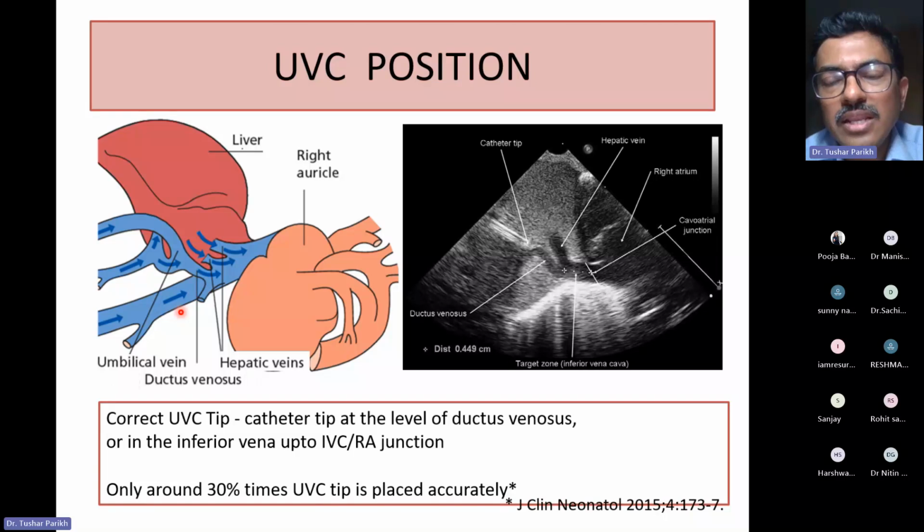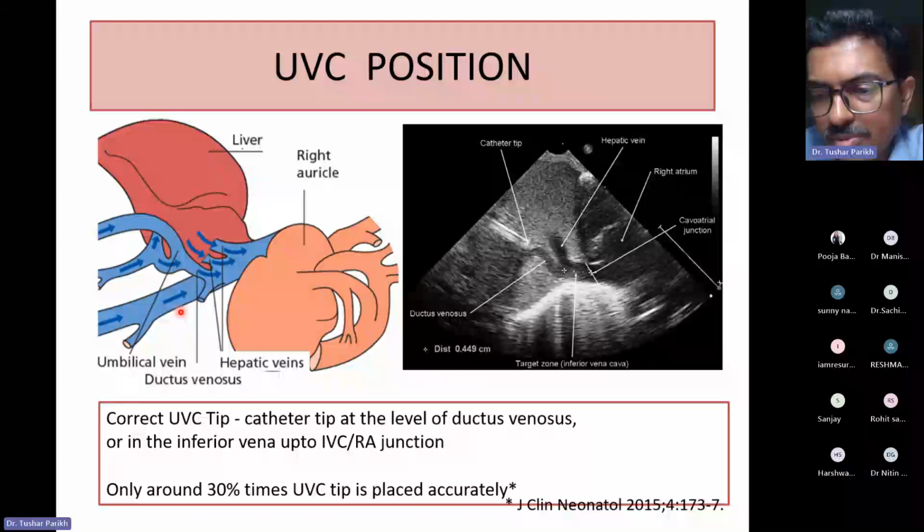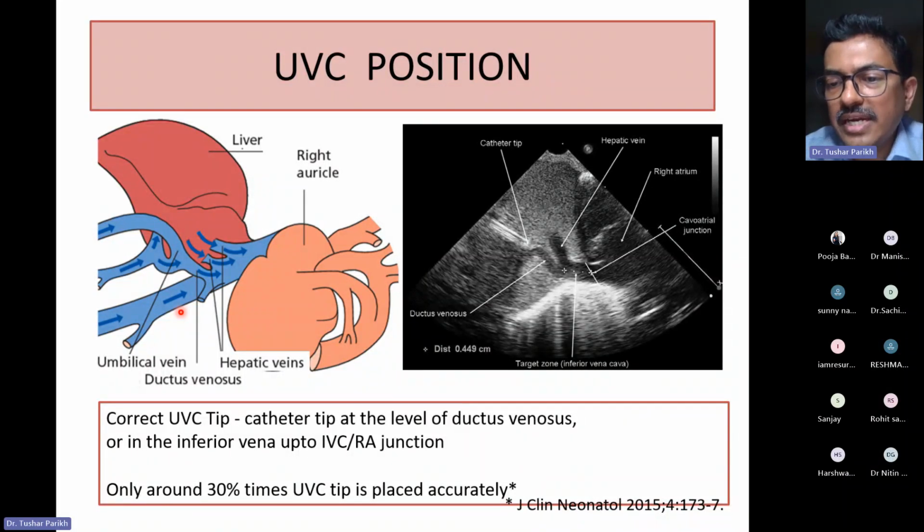Absolutely good question. As I said, the line catheter is not very ultrasound friendly. So to improve the visualization of the line, we do two things. One is while doing the procedure, so that you can actually see real-time movement. You withdraw, pull a little bit, and you will be able to see the tip position. The second thing to improve tip localization is that once we have done it, we inject a little saline, and that saline will be seen jetting. The jet of saline you'll be able to see from the tip. So two things: while doing it, the movement of the catheter will be seen, and you inject some saline and you'll be able to see the jet. That is how we improve the visualization of the line.